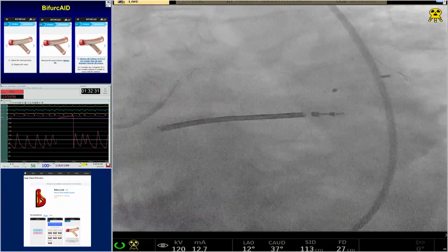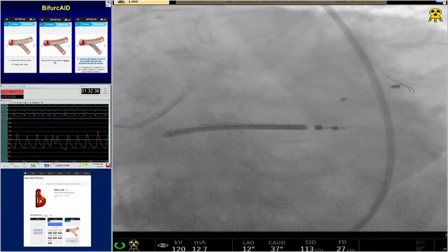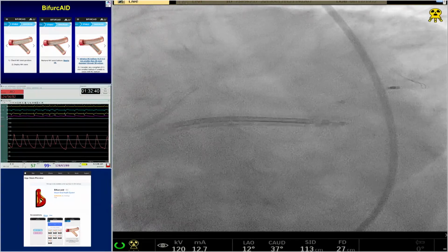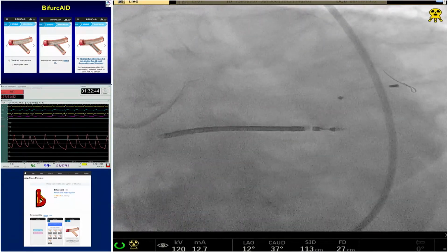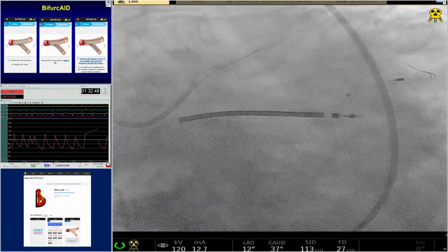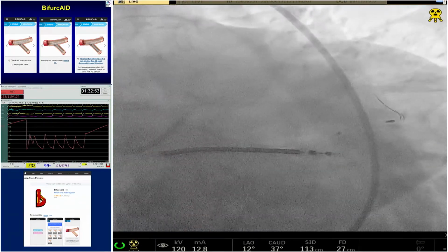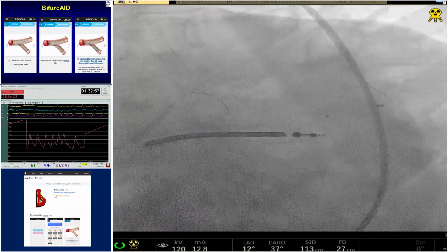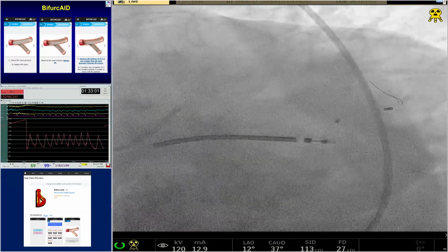Restenosis of the ostium, restenosis of that whole bifurcation system, mainly the LCX ostium. And the truth is that many times the restenosis looks angiographically bad, and if you do FFR it is negative. So there is this dissociation. You see very focal, short restenosis, and the FFR is 0.85, 0.83, almost negative.